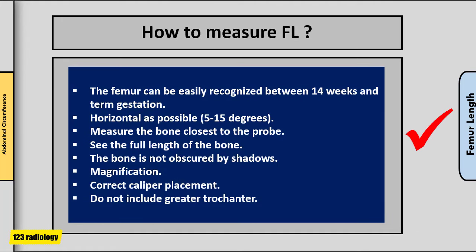To summarize femur length measurement: the femur can be recognized between 14 weeks and term. The femur should be as horizontal as possible. Measure the bone closest to the probe. Visualize the full length of the bone without shadowing. Magnification is important. Correct caliper placement is essential. And do not include the greater trochanter in the measurement.